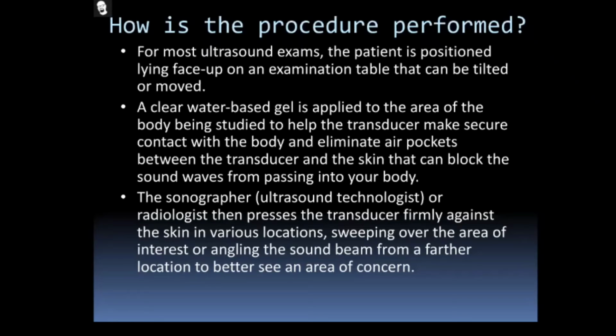A clear water-based gel is applied to the area of the body being studied to help the transducer make secure contact with the body and eliminate air pockets. That is the reason: air pockets between the transducer and the skin can block the sound waves from passing into your body.